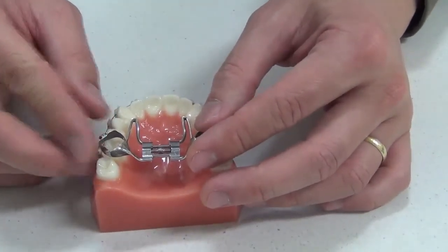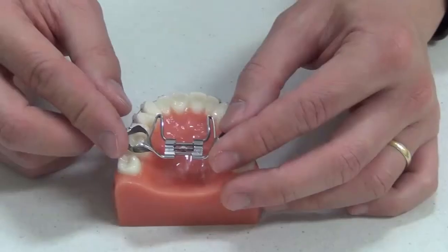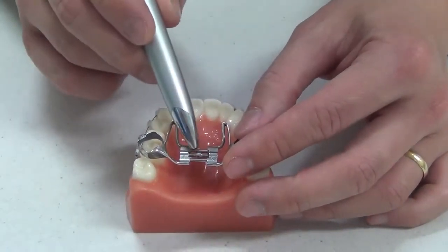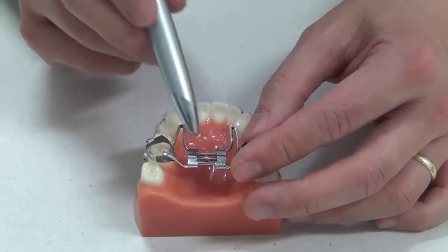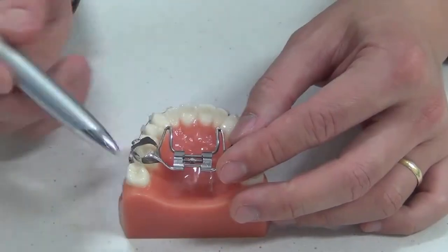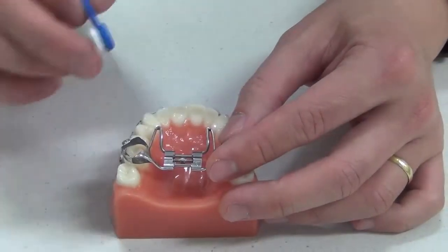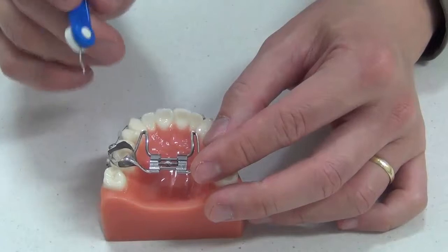The first question is when to start turning it, and the best time to do that is generally after you clean your teeth at night, so that this hole or centre bit that we see here is clean. This centre bit is a wheel, and in that wheel there are four holes. Each turn widens the upper jaw by about a quarter of a millimetre.